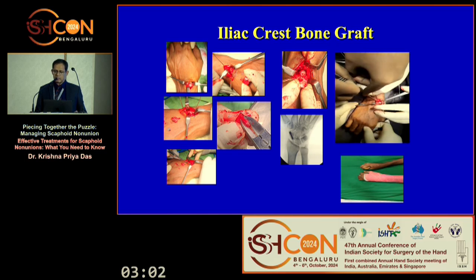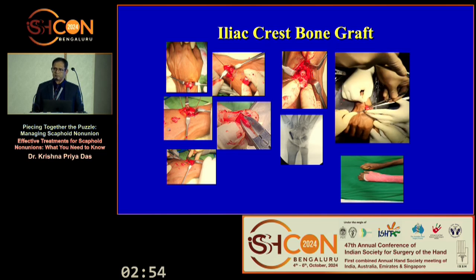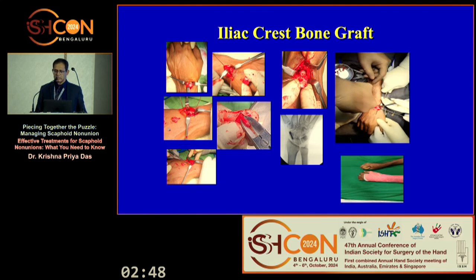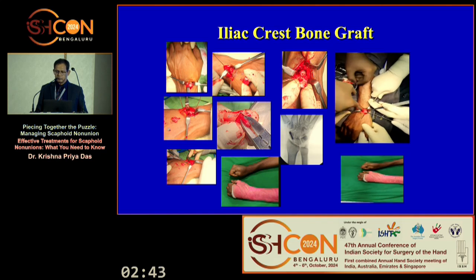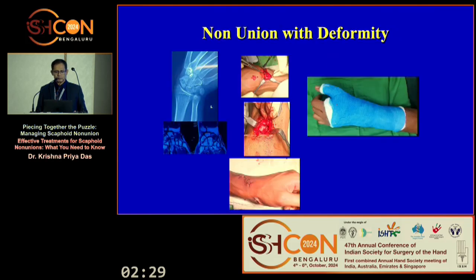Then again adequately debride the fracture site, and the bone is packed nicely, then fixed with the screw, and start mobilization as early as possible. This is the follow-up at 4 months: very good consolidation as well as range of movement, and the grip strength has also been achieved.